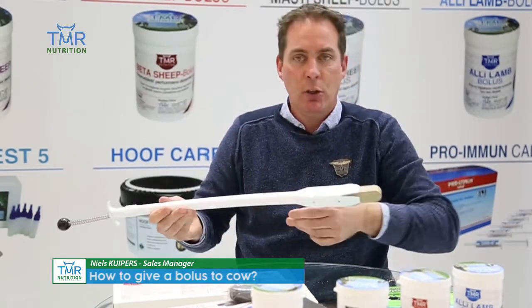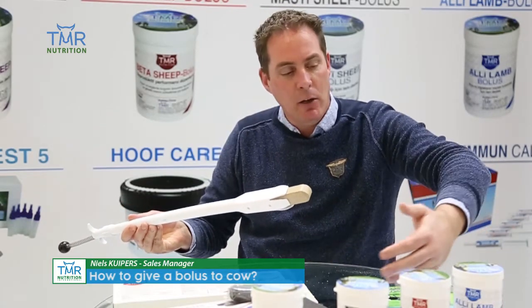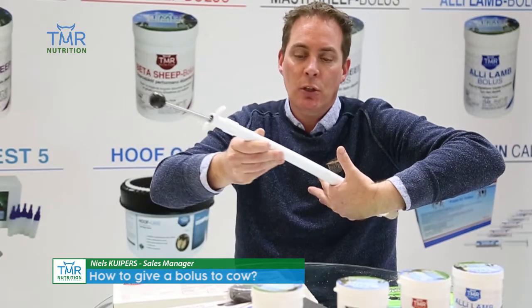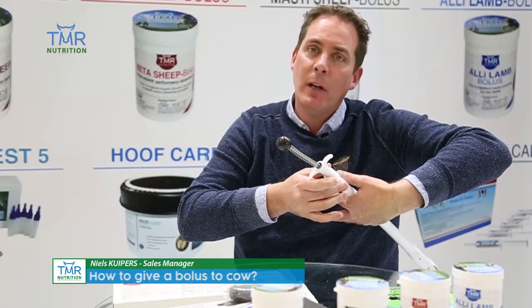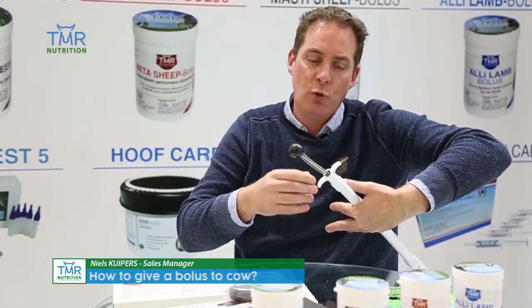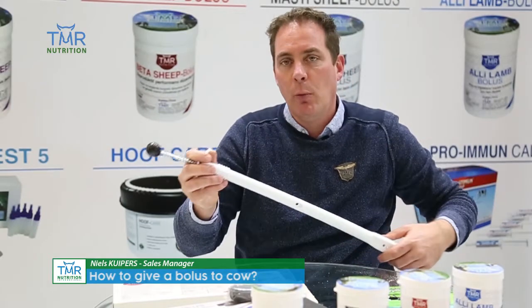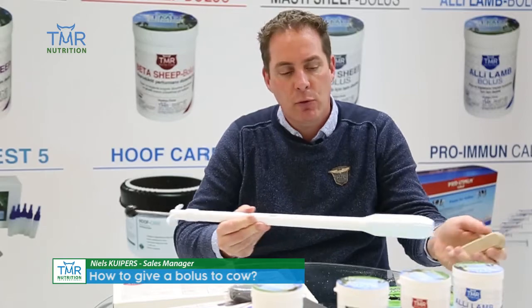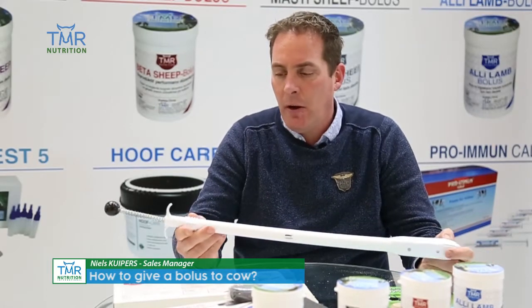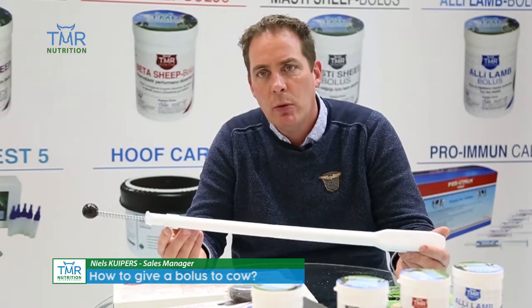When the cow is in the headlocks, you take the applicator underneath the mouth and put it in very slowly, giving the cow time to swallow. Then just push it and it will be safely placed in the rumen without any damage to the animal. This is a very fair and honest way of applying boluses to dairy cows.